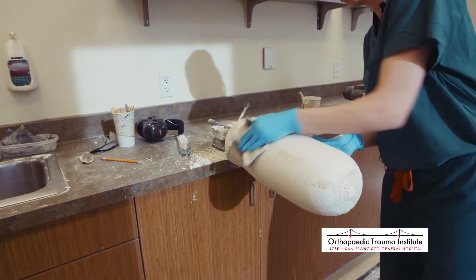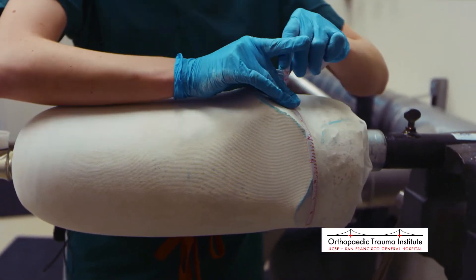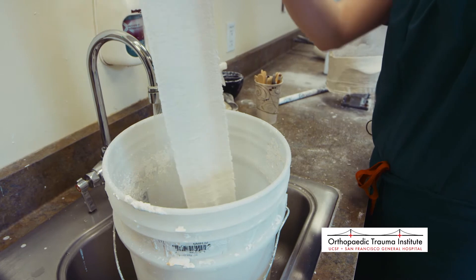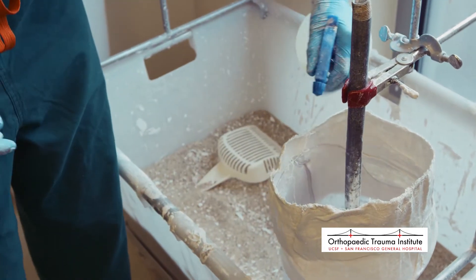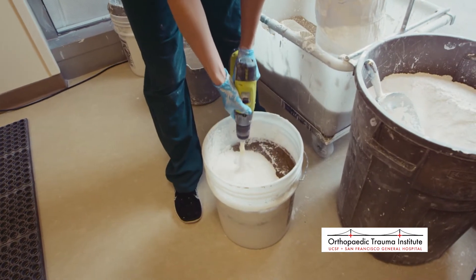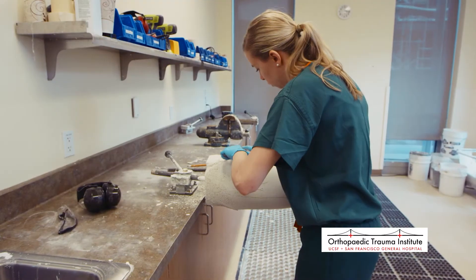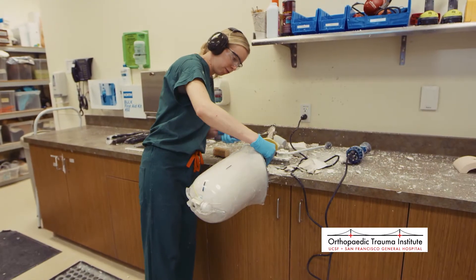Here at the orthotics and prosthetics workshops at the UCSF Medical Center, the quest to help amputees regain their mobility and independence begins in earnest. The crafting of a prosthetic limb is a collaborative process involving both the patient and the prosthetist. Here is UCSF Medical Center prosthetist and orthotist Hannah Dollard explaining the process.